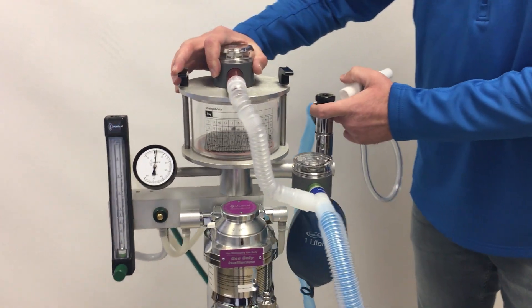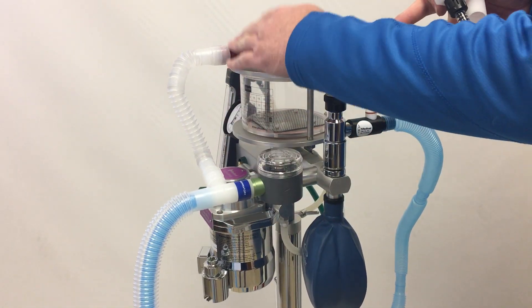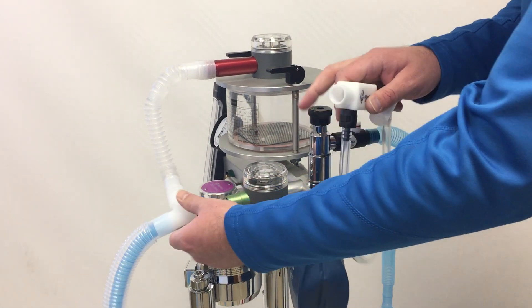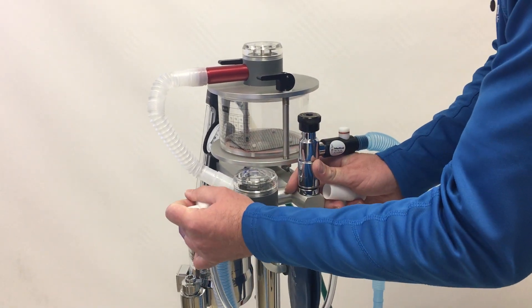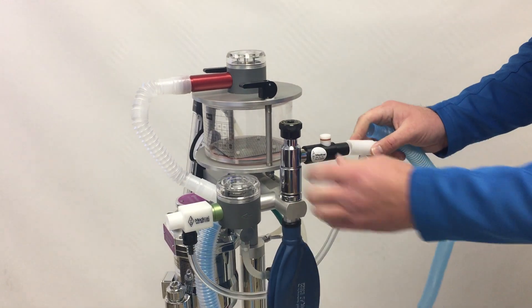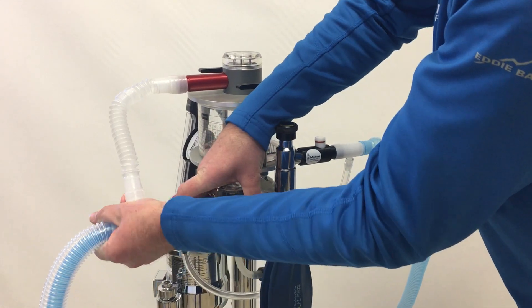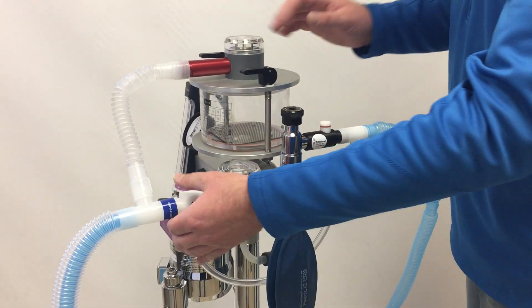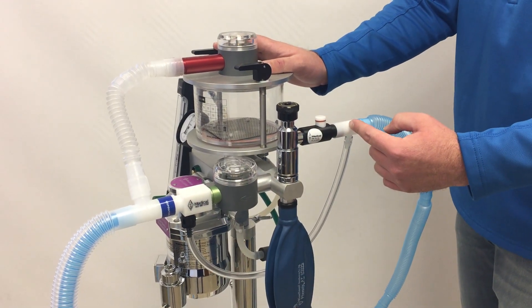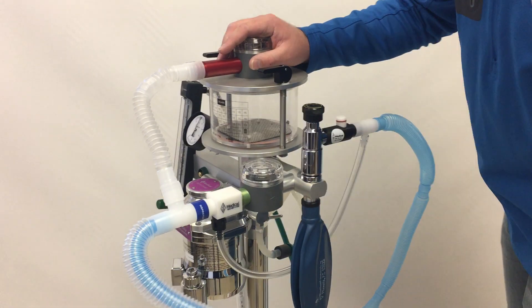Now we can connect the safety relief valve. It can be connected to either the expiratory or inspiratory port of the anesthesia machine. I generally prefer to put it as close to the pop-off valve as possible, but it functions fine on either. It goes in place of the exhaust and circuit connection, and will relieve excess pressure into the exhaust of the machine where it's taken out by the scavenger, with no exposure to operators.